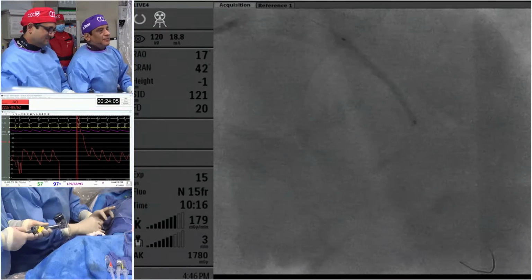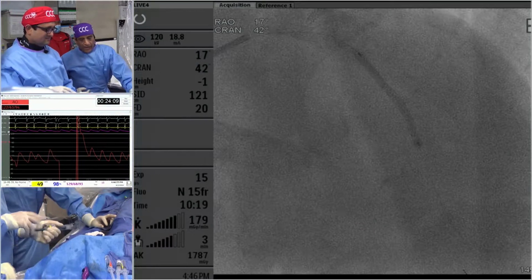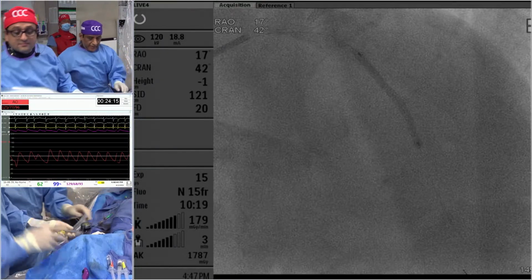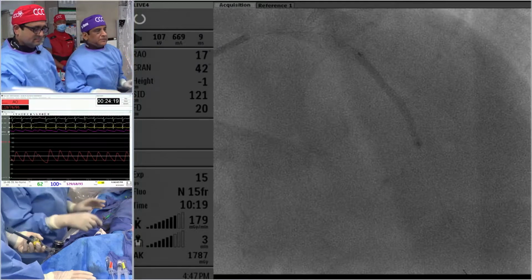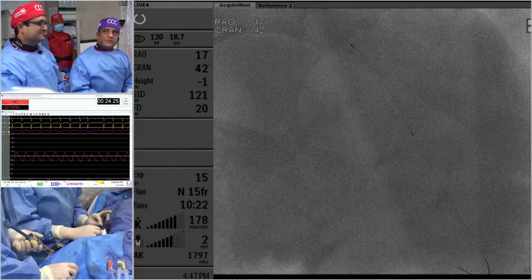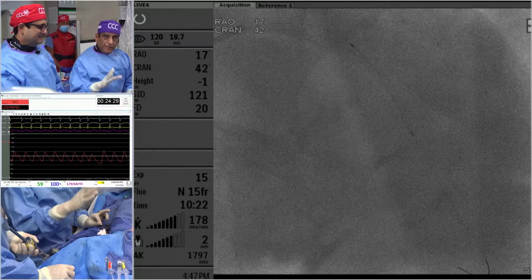Now I can tell you, there was a lot of discussion with the wiggle wire. I personally don't think anybody does more complex cases, because of my personal referrals, 1,500 cases, of which 800 come from outside, not even the Mount Sinai system. I did the obituary on the wiggle wire 5 years ago, and it's not needed because of atherectomy with the guideliner.